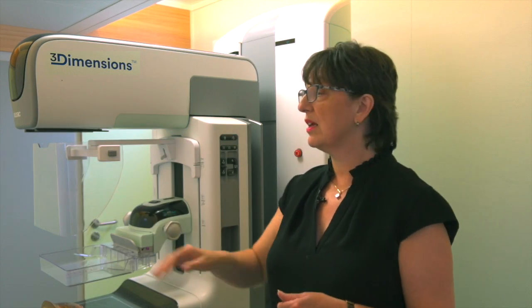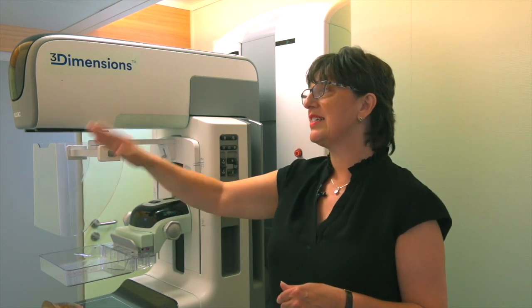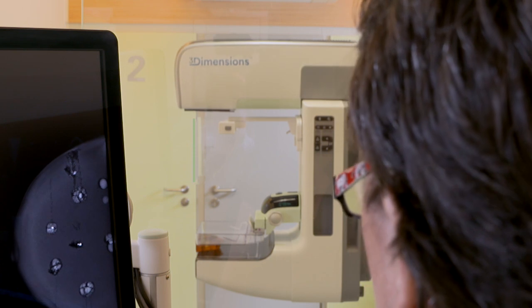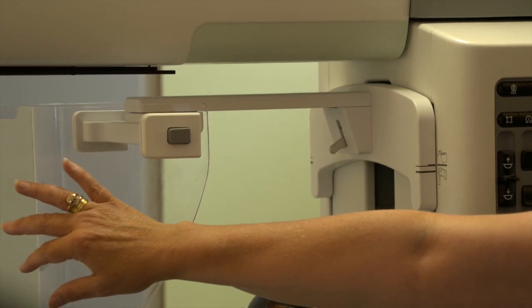When we're doing tomosynthesis images the patient will have her head against here, and as the tube is moving over it moves independently of the face shield, so the patient feels much more secure when she's standing here with her face against it.